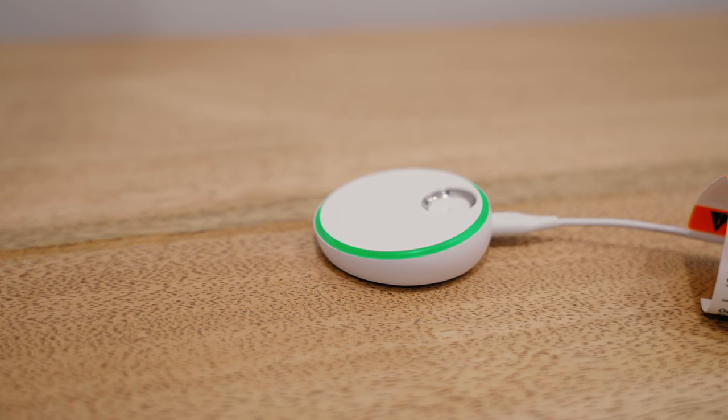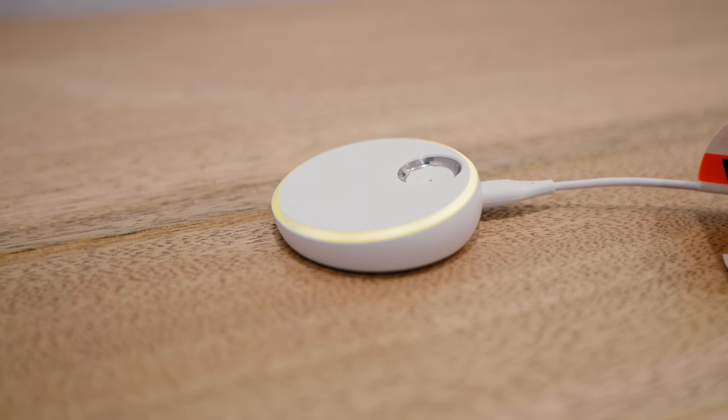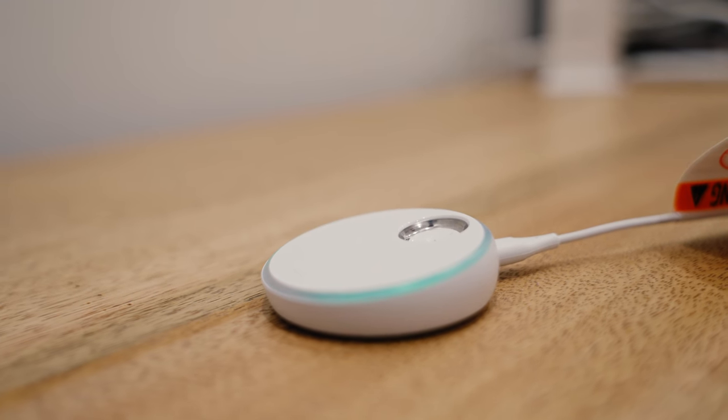The charging dock will light up and the colors of the lights signal different things. The white light means it is charging. The green light means everything is good — your baby's readings are good and it can sense them. Yellow means your baby might have kicked the sock off or is wiggling a little bit. A blue light means there is a lost connection. And red means something is wrong with your baby and you need to go check on them.